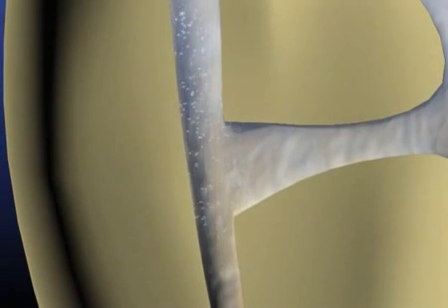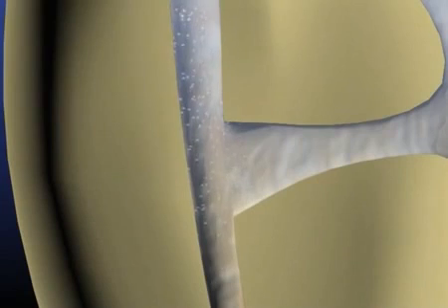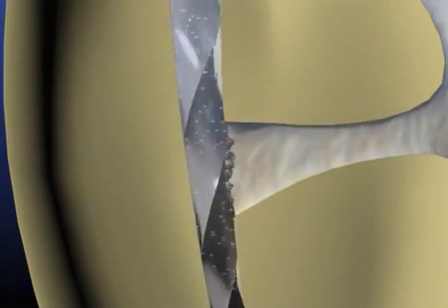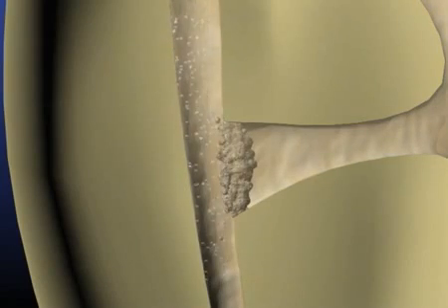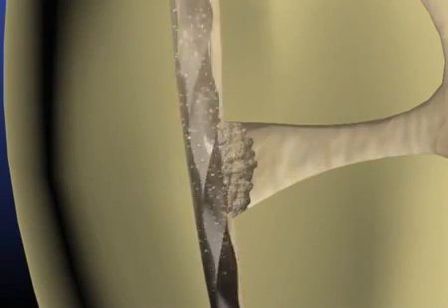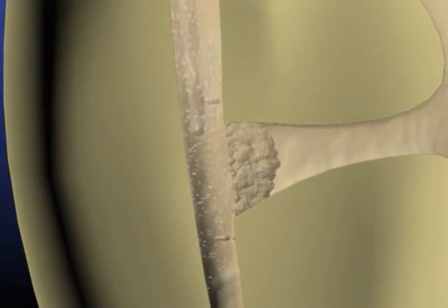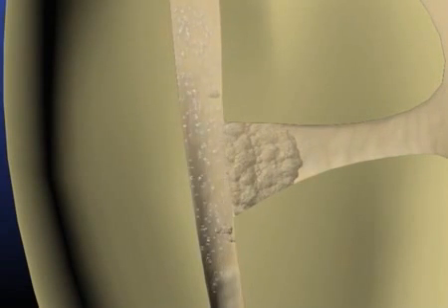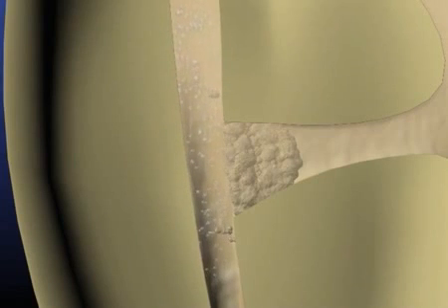Now let's look at how the anatomy gets obstructed when we don't use the proper protocol. Clinicians commonly use a series of nickel-titanium rotary instruments to prepare a canal. Each successively larger instrument performs its own unique work. Each instrument cuts dentin, and the dentin can get moved into the lateral anatomy and obstruct the canals. Dentin mud contributes to a lateral block.